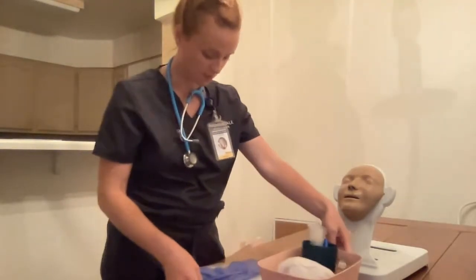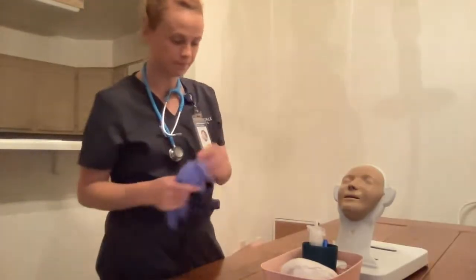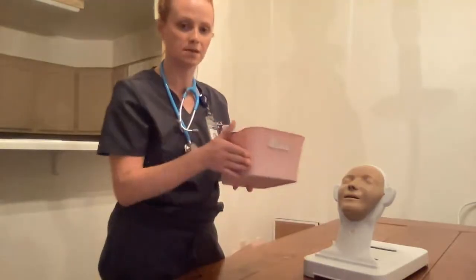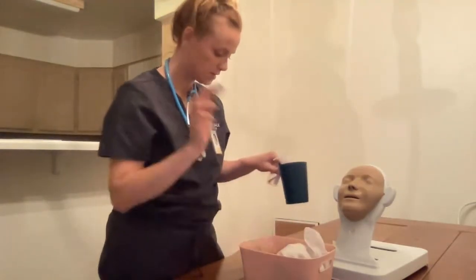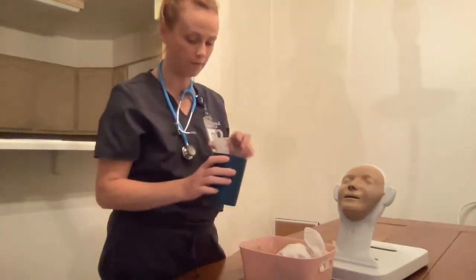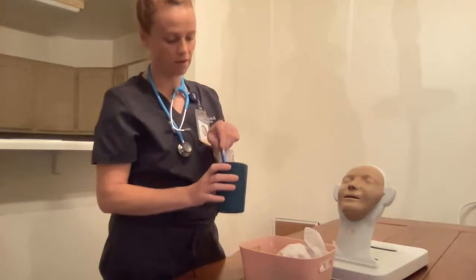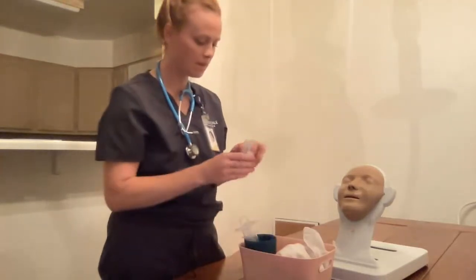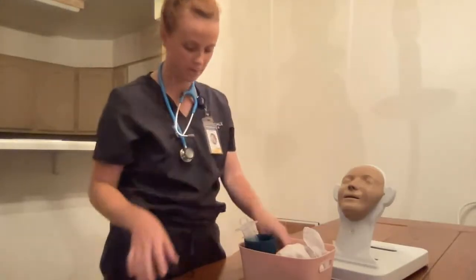My supplies for this video: a pair of gloves, stethoscope, nasogastric tube, and I have my basin here. I have a towel, tape, I have my cup for water just in case they need it, 60 mL syringe, my pen light. Then I have a specimen cup with my pH indicator and some lubricating jelly.